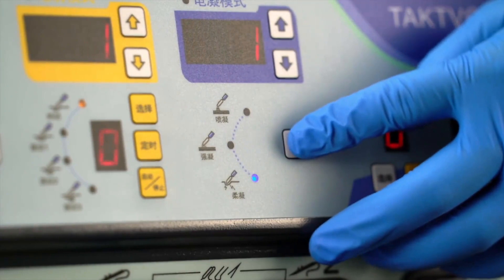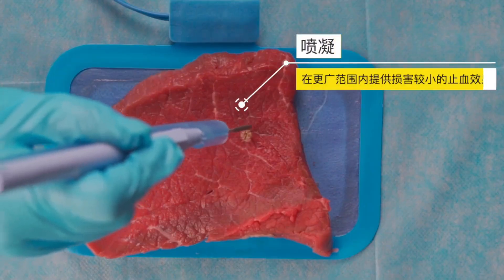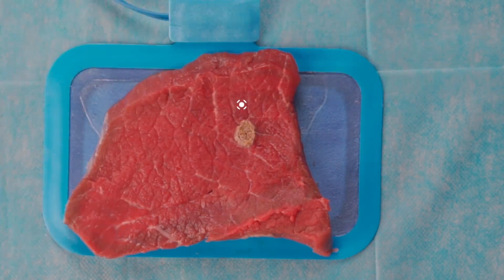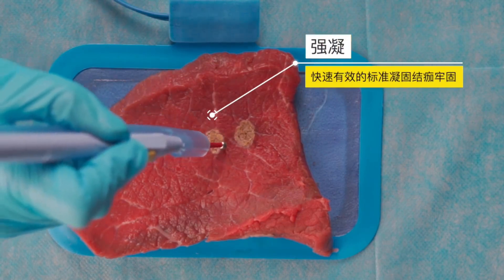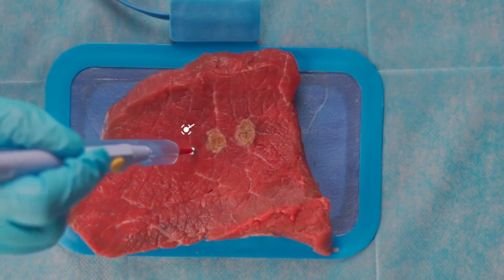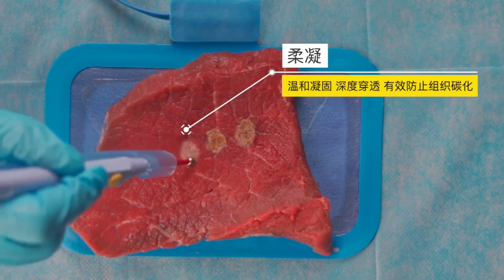In monopolar mode, the S300D has three coagulation modes: spray coagulation, forced coagulation, and soft coagulation. We push the buttons to switch the coagulation mode and set the power. The spray coagulation mode can achieve hemostasis over a wider range with less damage to tissue depth. The forced coagulation mode is a fast and effective standard coagulation with a large coagulation range and firm scabs.